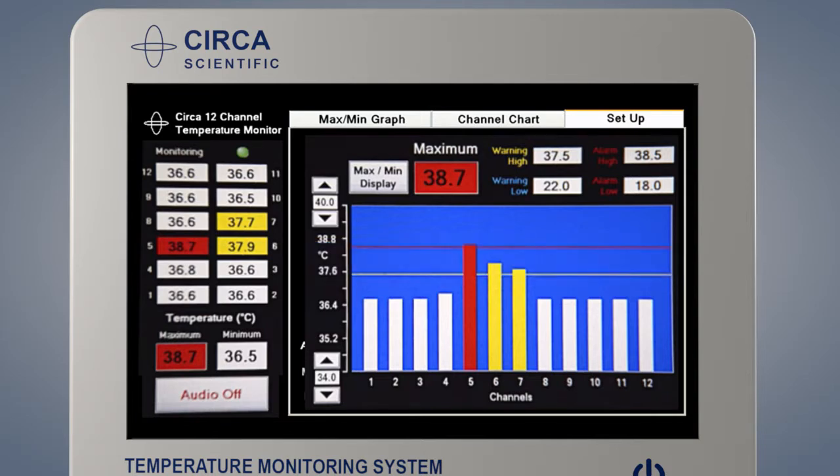The scale of the graph may be adjusted using the up or down arrows on the Y axis of the graph. The individual temperatures are displayed numerically along the left side of the screen. The maximum or the minimum is displayed in the large box above the graph. This box will display the hottest or the coldest temperature. The max-min display button allows you to switch the screen between maximum and minimum depending on the type of procedure being done.